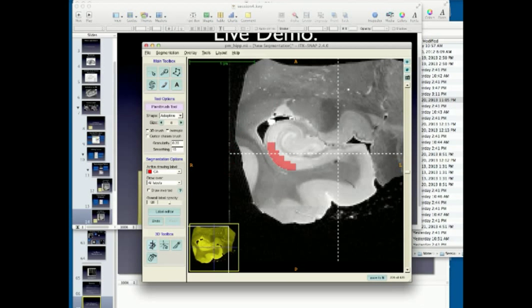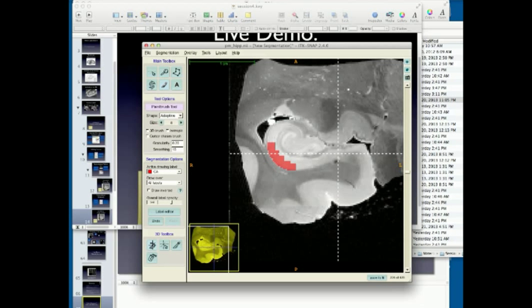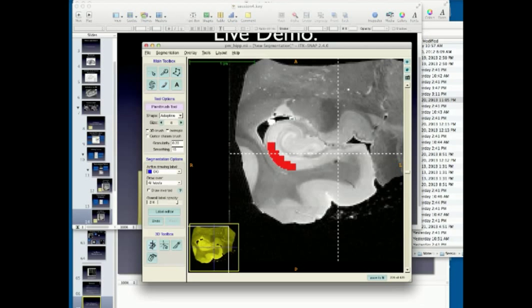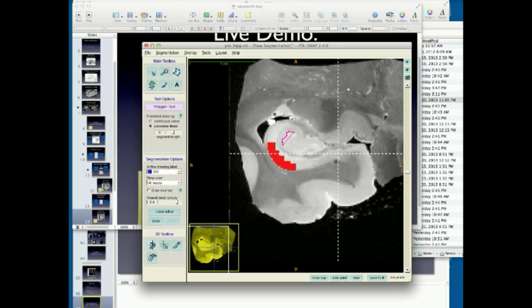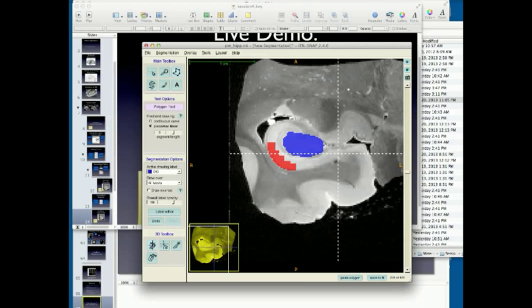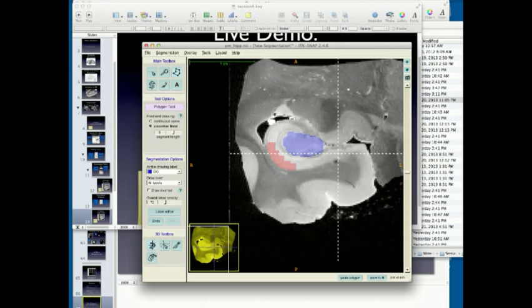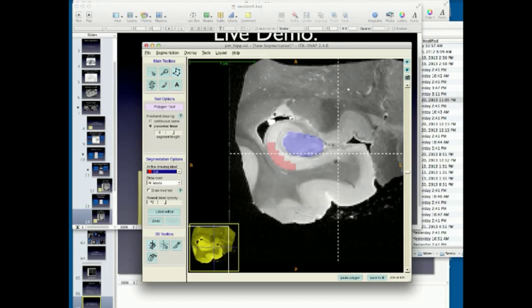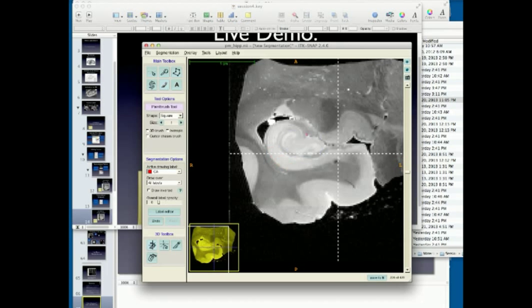Another thing to mention is something Paul talked about, is that you can toggle the segmentation on and off and also change the opacity. So this is important because you want to see what you're drawing on top of. You know, if you have it turn all the way up and you draw all over, you don't really necessarily know where to make these bounds or make these changes. So you can toggle this on and off with the S key or use A and D to make it more translucent or more opaque. When I'm doing segmentation, I usually keep it pretty translucent so I can still see the anatomical features underneath the label. So here you can see that maybe CA continues in a little bit more than I have here. So I could just use the paintbrush to adjust that. Something like that. And I'll try to give you plenty of time for the exercise to work through this. I know it's kind of a lot.